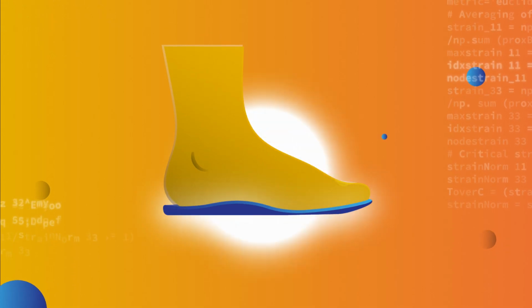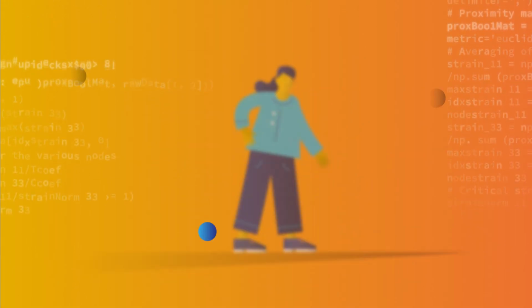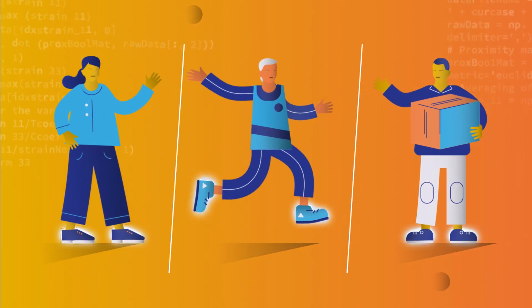Insole would allow doctors and patients to find which insole produces the most optimal outcome, improving posture, movements, and ultimately quality of life.